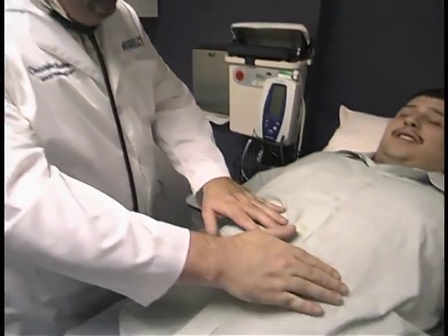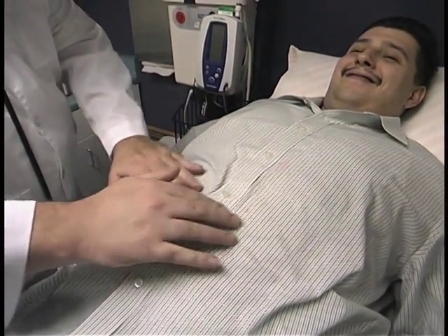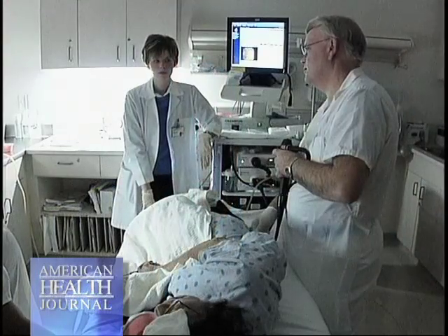The day of the procedure you have nothing to eat or drink, typically at least four to six hours prior to the exam. You have to present yourself to the endoscopy suite, where an IV is placed so that medications and fluids can be administered intravenously to sedate you and relieve any discomfort during the procedure.